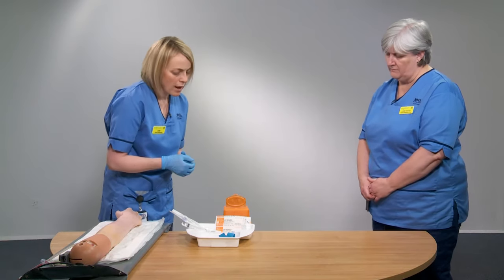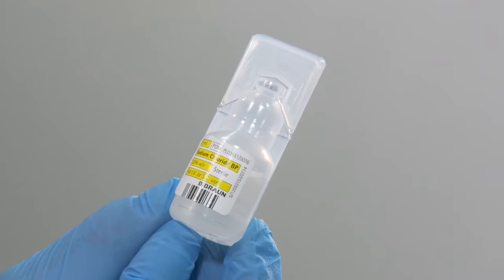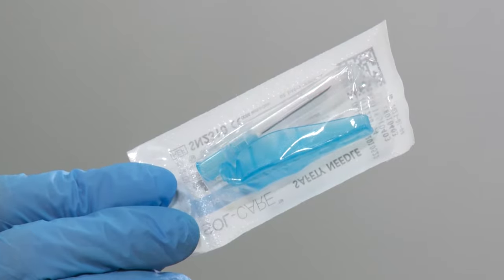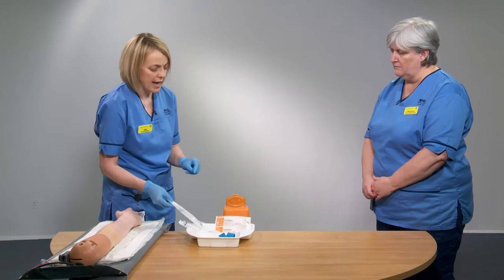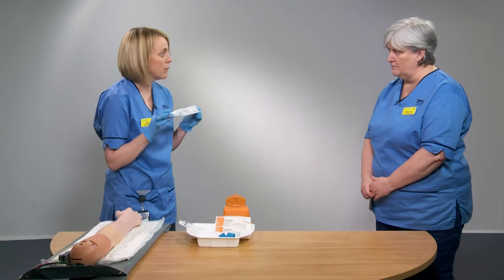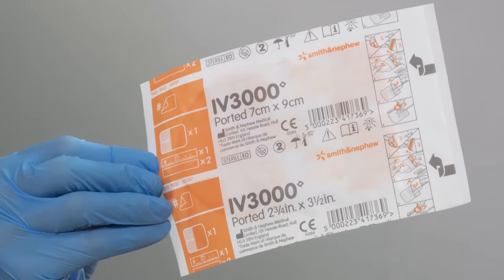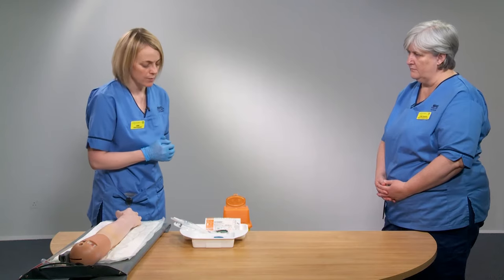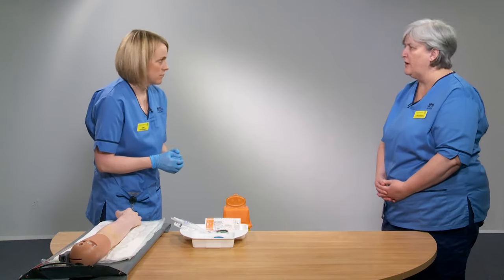Because the device is staying in, the other things you need include a flush — so you would need your 10 ml syringe and your 0.9% saline flush, which we've already checked. You also need a single extension needle-free access device, which we will prime with our saline prior to starting the procedure. Finally you need a dressing to secure the cannula, and a disposable tourniquet. Before starting, the best thing to do is to have everything prepared.